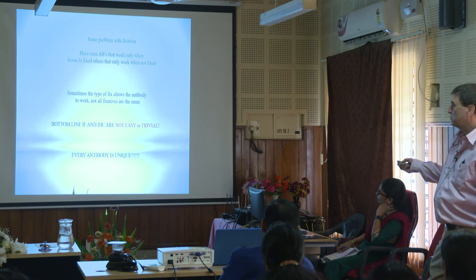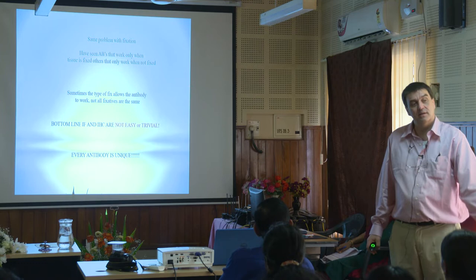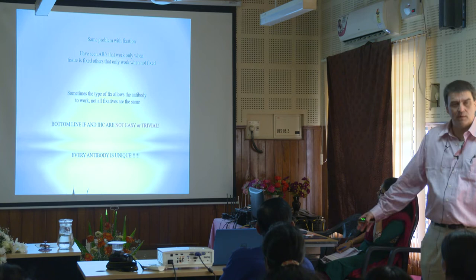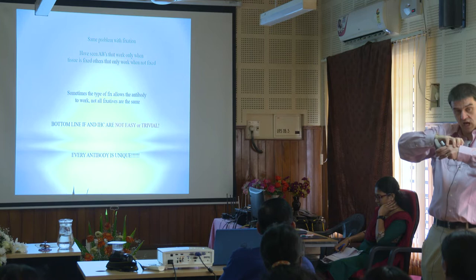But most of the time, fixation, like, again, going back to those catalogs, it'll tell you it'll work with this kind of fixation sometimes or that kind of fixation, or you look in the literature. Because I've had some antibodies, for whatever reason, you have to acetone fix. It's the only way it works. I mean, they're very unique. Think about it, though. They're unique, trying to recognize a unique structure. You're trying to use a 3D key to fit in the 3D lock. It's very specific. So don't imagine anything working that shouldn't.